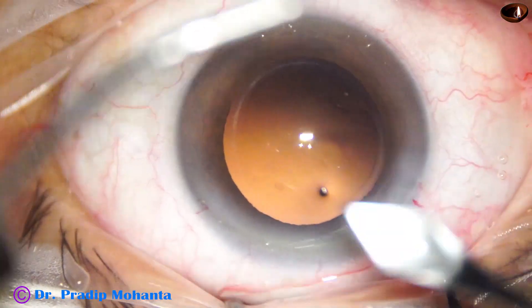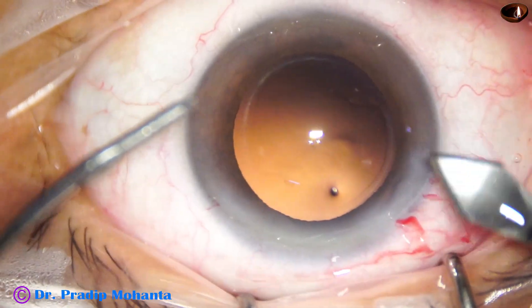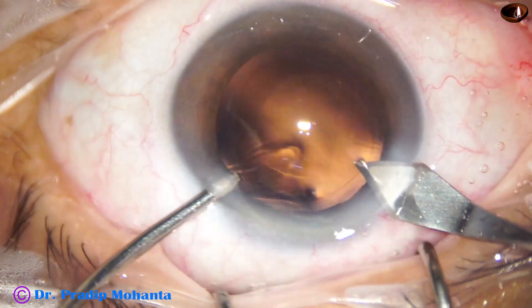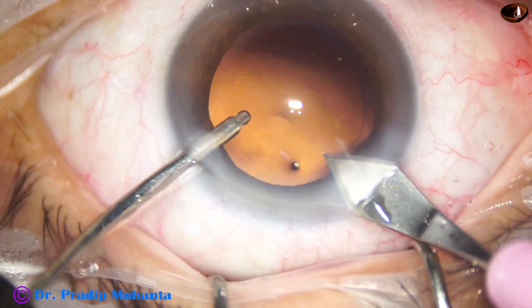The main wound is enlarged slightly with an on-cut because a B cartridge is going to be used for IOL injection.